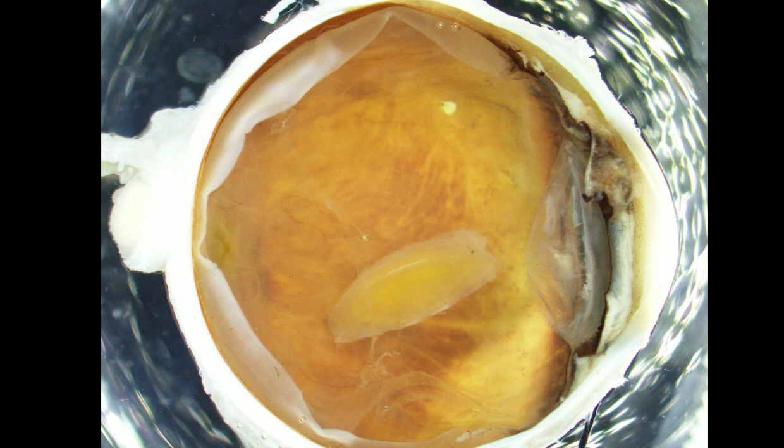Sometimes, and often, the small uveal melanomas are rarely enucleated. As we heard from Claire, they're usually treated with radiotherapy with plaque or other modalities. But this is Mike Giblin's patient. I dislodged that lens artifactually when I was sectioning, so that's why you're seeing it in the vitreous cavity. But this was a ciliary body and iris melanoma that was symptomatic, and the patient wanted it out.